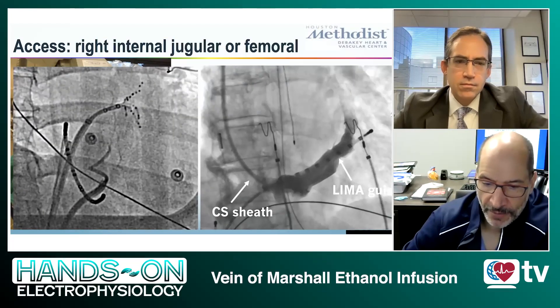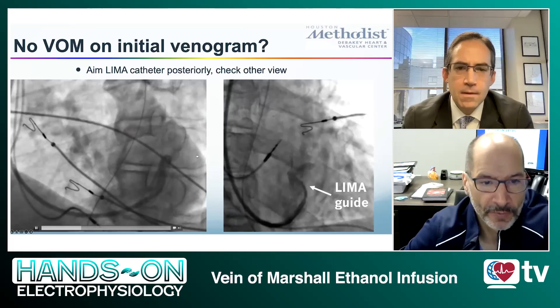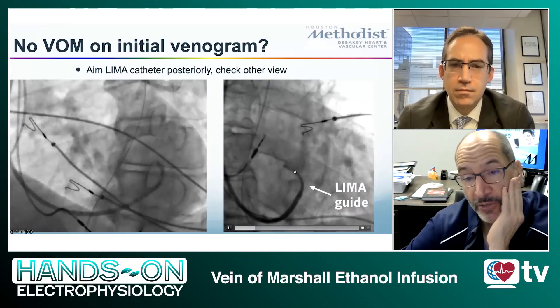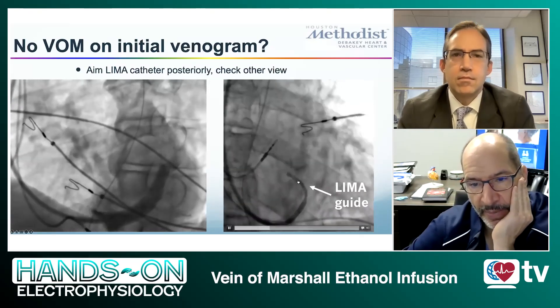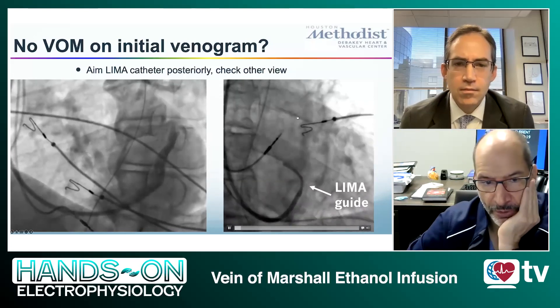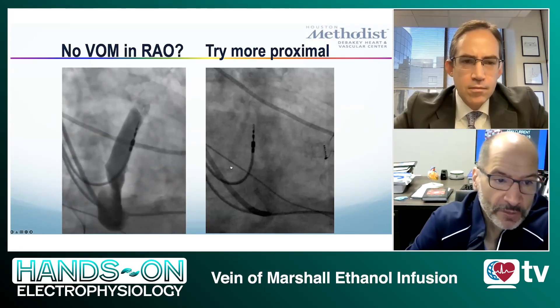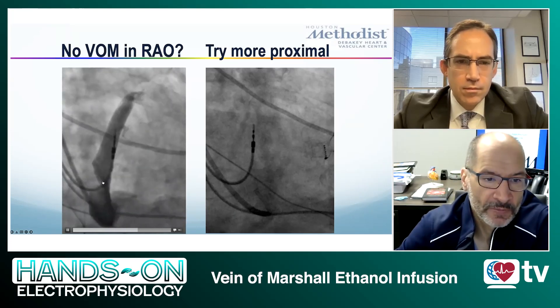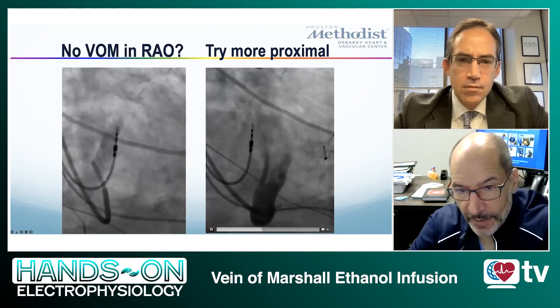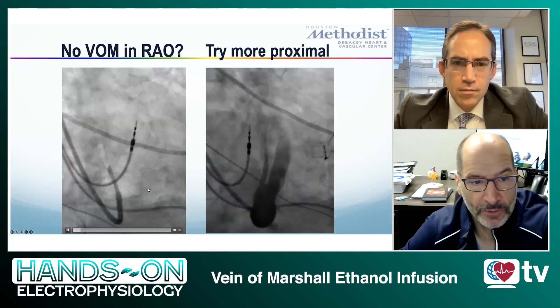A few anatomical variants can become an issue when starting this procedure. Sometimes you don't quite see the vein of Marshall, particularly in LAO where it may overlap with the CS. It's important to select the right fluoroscopic projection — usually a shallow RAO works best. The LIMA is torqued posteriorly and superiorly in the CS to engage the vein of Marshall. Sometimes you don't see the vein of Marshall at all because you're injecting too distally. You may see a filling defect suggesting the valve of the Vieussens — go just proximal to that valve, and sure enough you will find the vein of Marshall, even if it's a particularly large one that was not apparent in the first venogram.